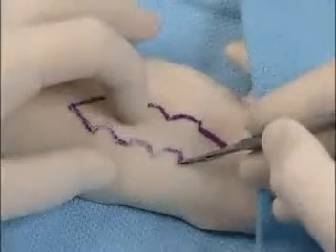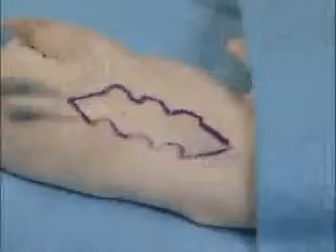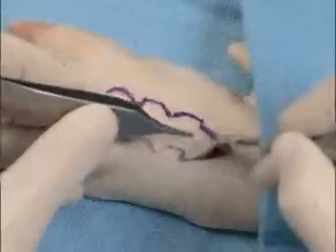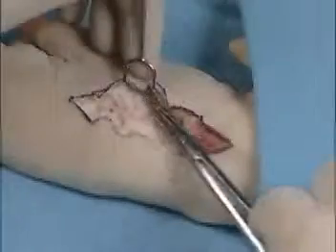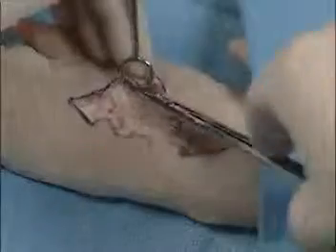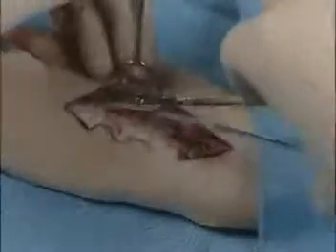Because of the toughness of the pig's skin, the geometric shapes here are accentuated, certainly larger than what we would perform on a human in scar revision technique. Here we can see the undermining, using either a 15 blade or the scissors. Note the double hook, and third instrument, as it were, is the middle finger of the surgeon's left hand, while the scissors are dissecting using the tip upward technique so as not to cut any of the important deep structures.